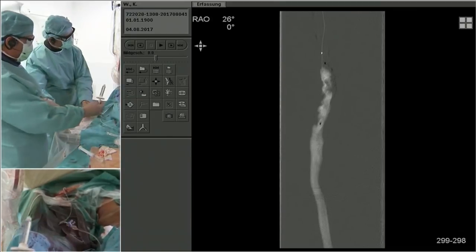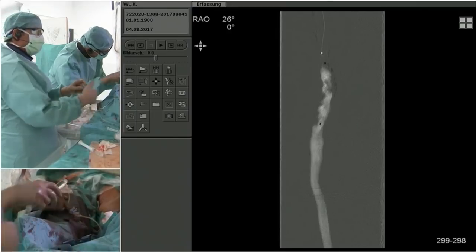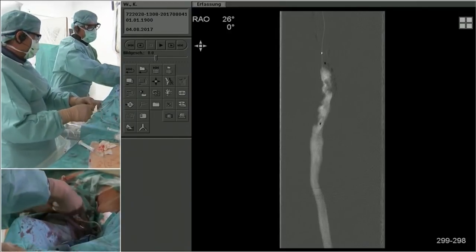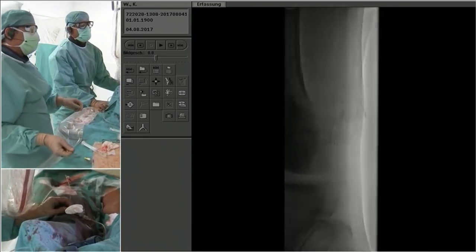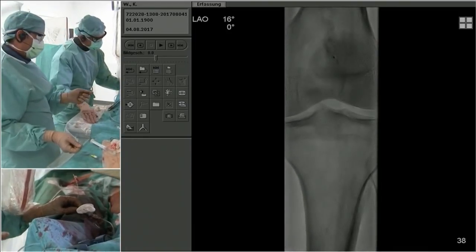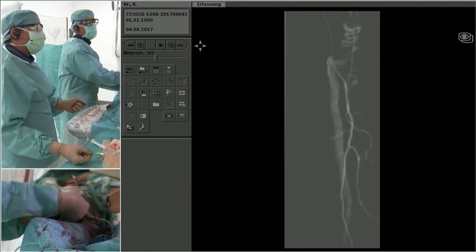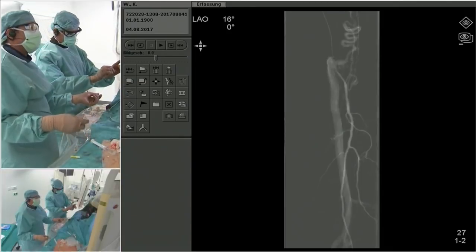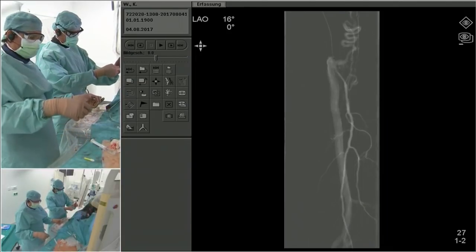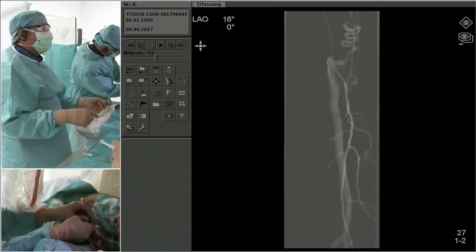Can I give it to you here? So while Andrej does this, I think this is a beautiful demonstration of wedging the balloon and opening the distal cap. Any other comments from the panel, Ian and John? Well, now it's going to get interesting how you treat that. I was curious, Andrej, about your idea of aggressively dilating and then putting a Viabahn and then paving with the Supera. If you aggressively pre-dilate, why wouldn't you go straight to Supera if you don't have a rupture?